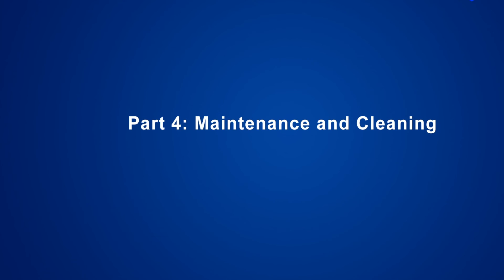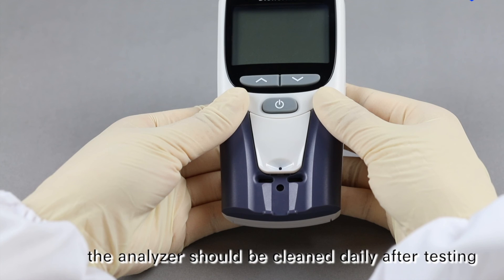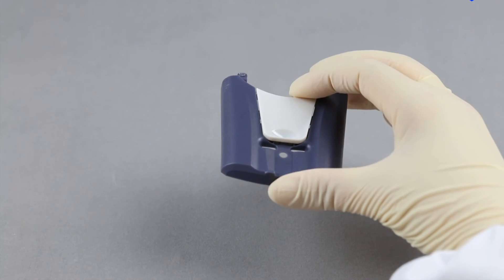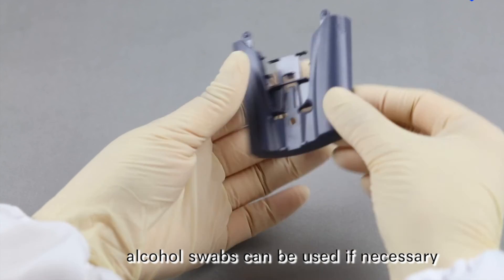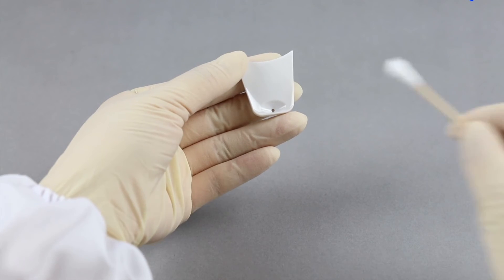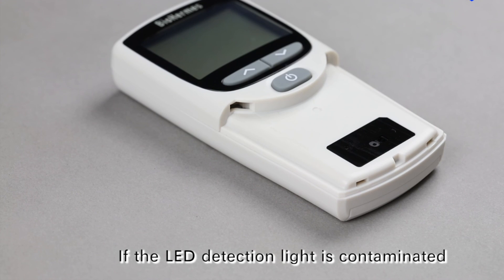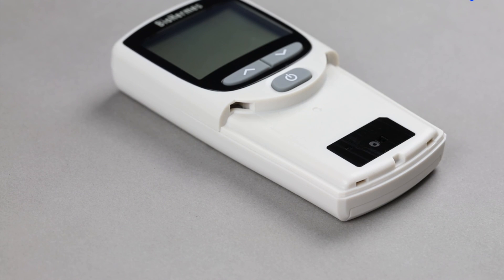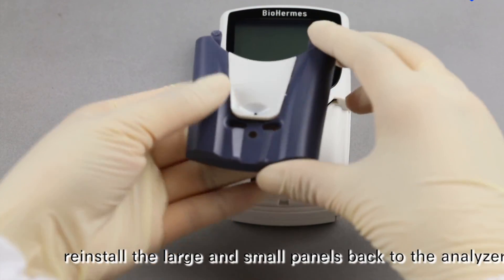Part 4: Maintenance and Cleaning. In order to get accurate results, the analyzer should be cleaned daily after testing. Remove the large and small panels from the analyzer and use a swab to clean them carefully; alcohol swabs can be used if necessary. If the LED detection light is contaminated, wipe the area in a single direction. After cleaning, reinstall the large and small panels back to the analyzer.